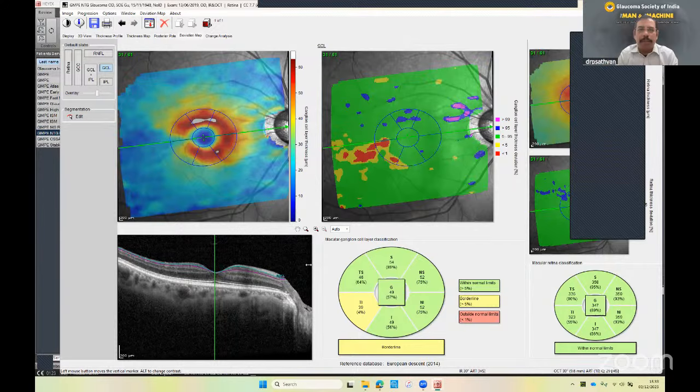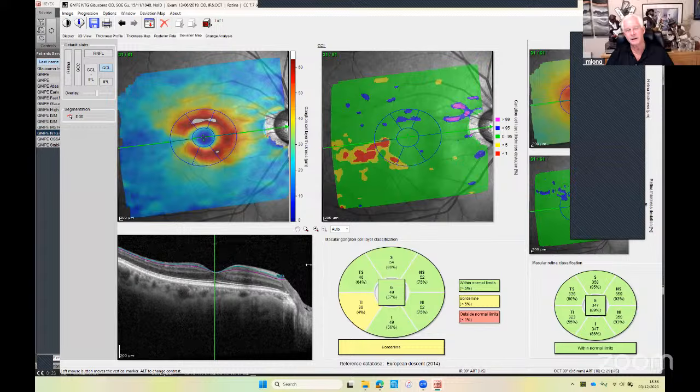Yeah. There are a lot of motion artifacts also in myopic eyes, and fixation losses. It's quite challenging in myopic eyes. I think so. If you have good eye tracking, you have at least the best opportunity to try to stabilize the information that you're getting from your OCT.